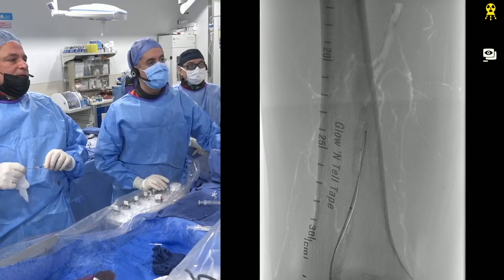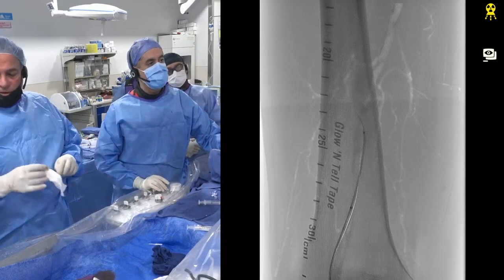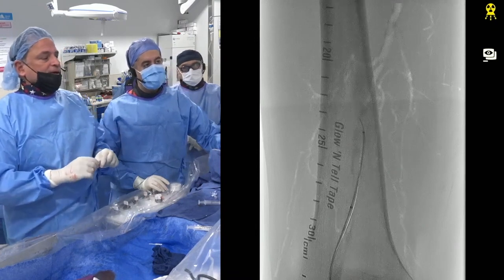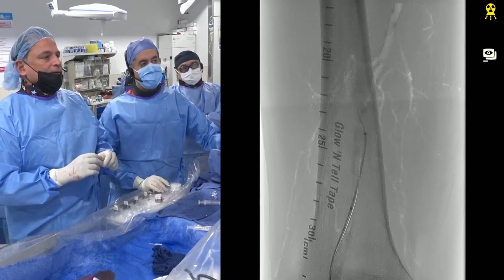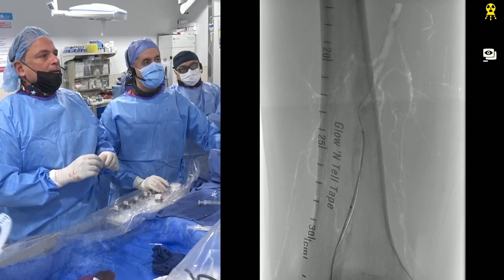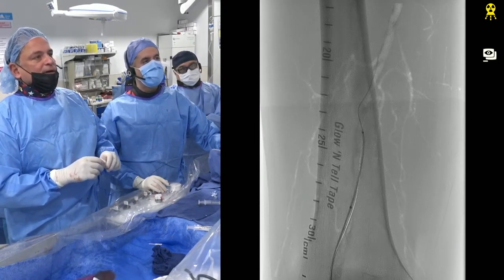Yeah, we've tried that multiple times here. I've come back multiple times. It just seems to be getting back in that. We could pull back all the way distal and try again with another plane. Yeah, always start again from the very beginning. Maybe just go all the way back to that calcium.